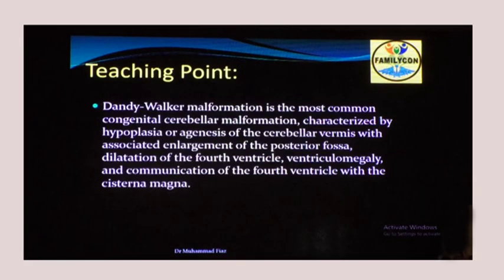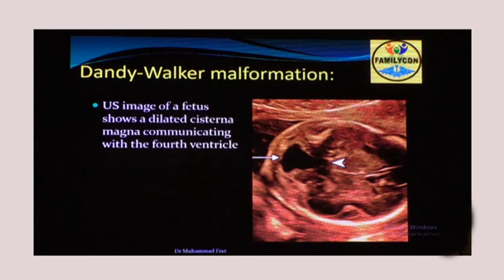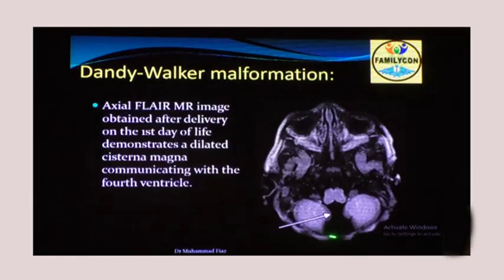Teaching point: Dandy Walker malformation is the most common congenital cerebellar malformation, characterized by hypoplasia or agenesis of the cerebellar vermis with associated enlargement of the posterior fossa, dilatation of the fourth ventricle, and communication of the fourth ventricle with the cisterna magna. The ultrasound image shows a dilated cisterna magna communicating with the fourth ventricle and hypoplasia of the vermis — a typical example of Dandy Walker malformation.